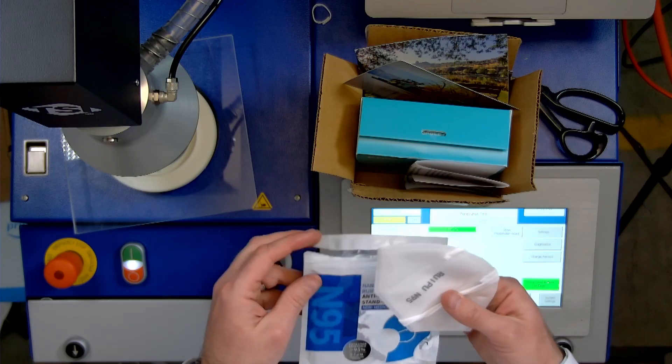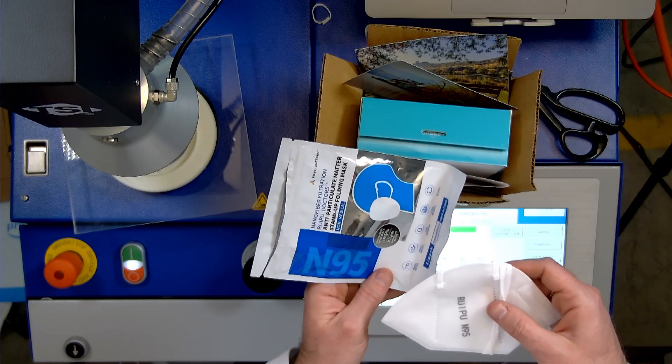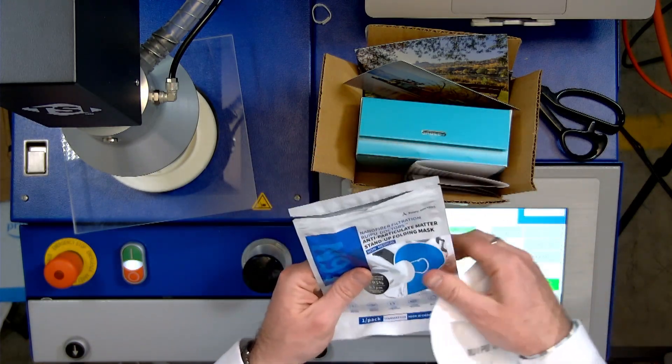So the foil means that it's a barrier package, which is actually really good. That means it's probably not going to have any smells. Oh wait, it says N95. Look at that. This is not N95. Doesn't say KN95. It says N95. This is a fake.